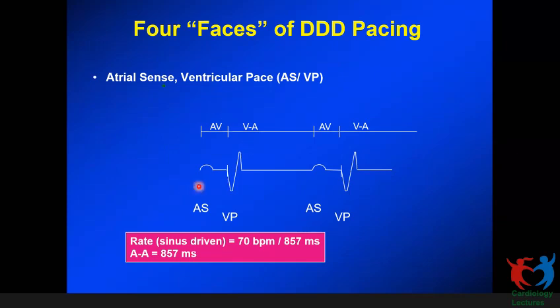But the additional advantage of this is that in a patient that has a normal sinus node function, without making use of the pacemaker's mechanical rate response, you are leveraging the patient's own sinus node based natural rate response, which will be more physiological and appropriate for this patient. So this is functionally a VDD mode, right? So we are not pacing the atrium. So in a patient that has a normal sinus node function, a functional VDD or a dedicated VDD will not only provide the AV synchrony, it will also provide the most appropriate rate response for your patient.